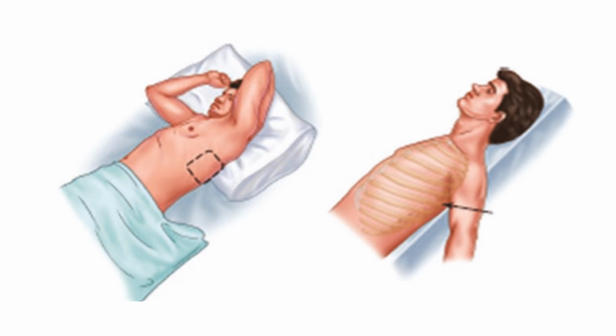2. Sterile skin preparation with a sterile drape. 3. Anesthetize the appropriate area subcutaneously up to and including the rib periosteum with 5 milliliters of 1 to 2% lidocaine with epinephrine.